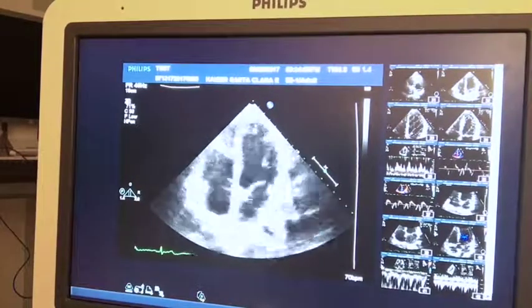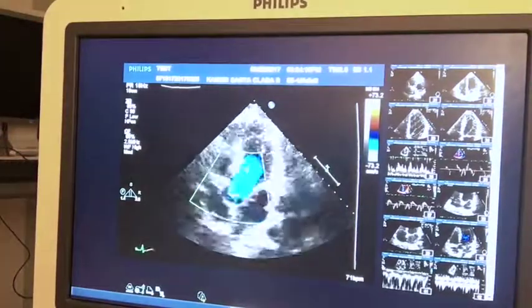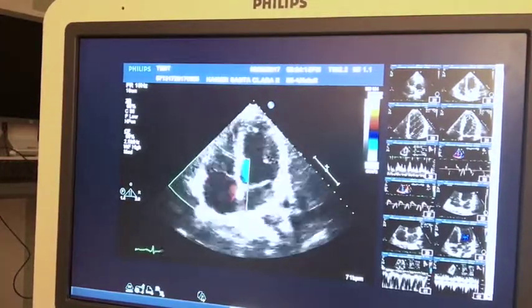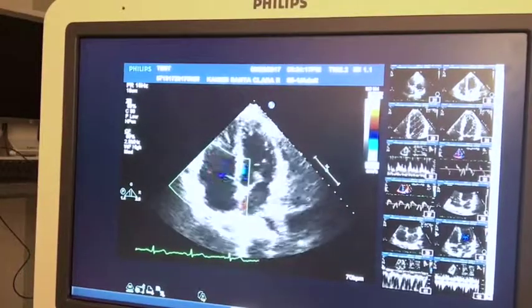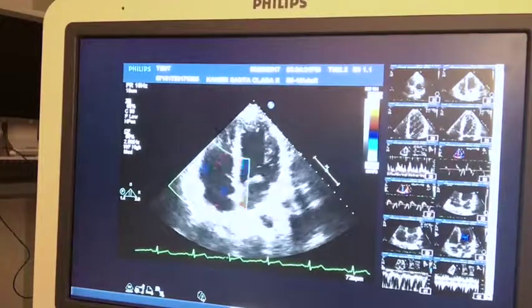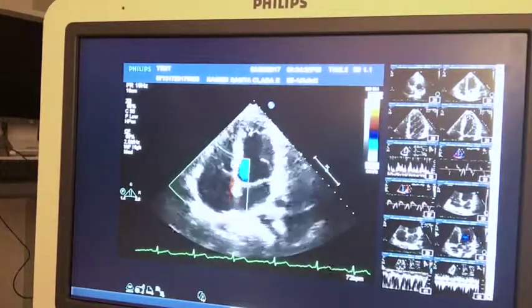Okay, so that would be telling me if their pericardial effusion was significant, or hemodynamically worthwhile to comment on. Okay, so that's why you would do it. If it's actually tamponade, that's your question.